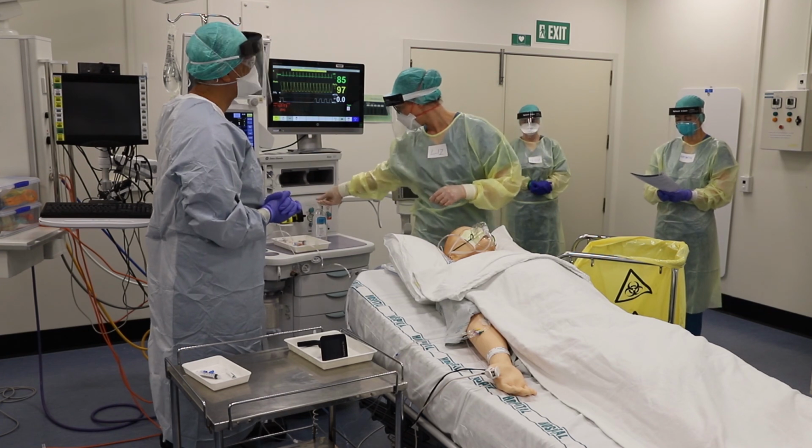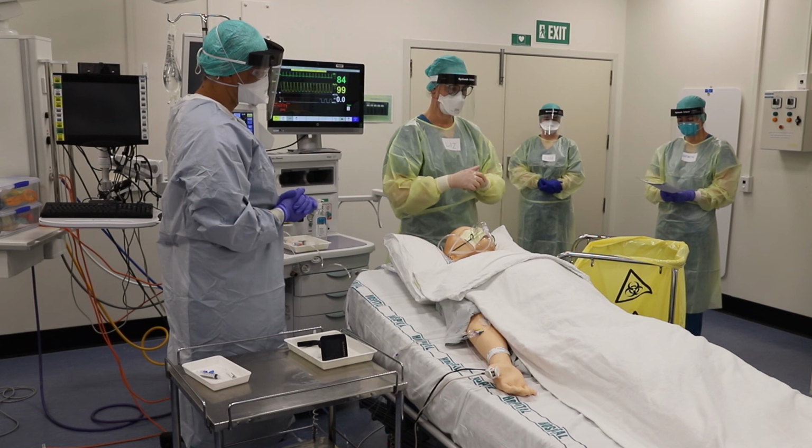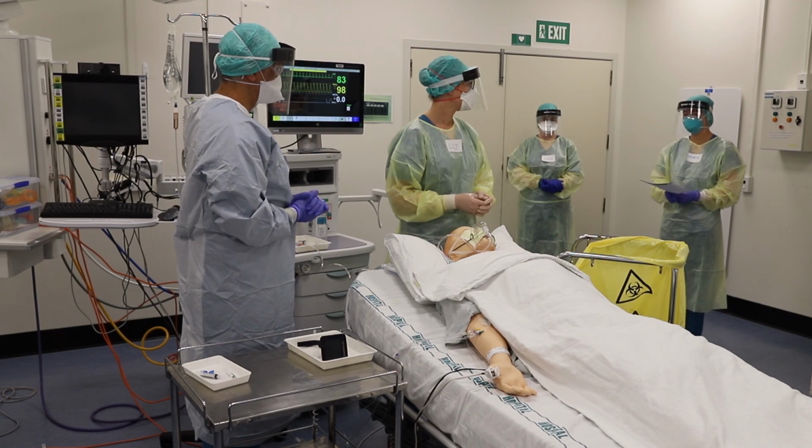I will start the 10-minute stand-down timer now. Leave the suction under the pillow. After the patient leaves the room, the suction is turned off and disposed of along with the canister.